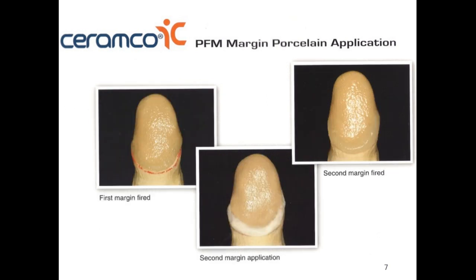Another important aspect is that when we bake the porcelain, the porcelain usually shrinks, so we might need to do a second application to achieve the desired shape. We added porcelain the first time covering all the way to the margin, we fire it, but during the baking process the porcelain shrunk a little bit. So we need to add a little more shoulder porcelain — apply a separating agent on the die, build up with shoulder porcelain, and then fire it again.